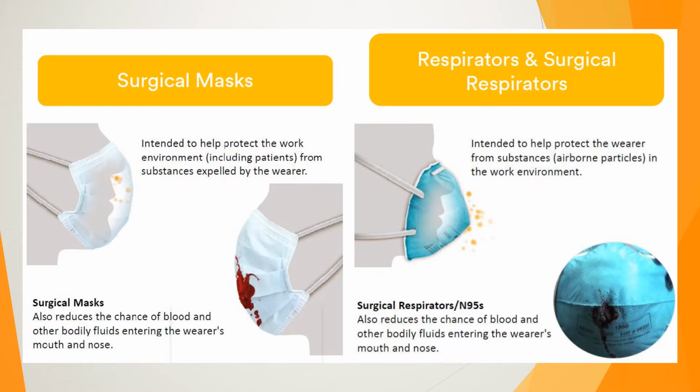It is interesting to note the difference between surgical masks and P2 or N95 masks. A surgical mask can help reduce the burden of particles in the environment. They do this by helping to capture a person's respiratory particles as they talk, cough, or sneeze. As the fit of a surgical mask allows for a lot of airflow around the mask, only a small amount of the air that you breathe through the mask is actually being filtered.